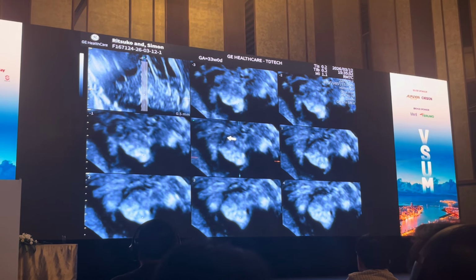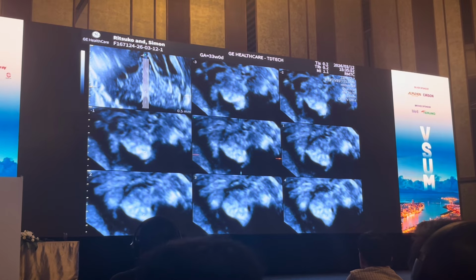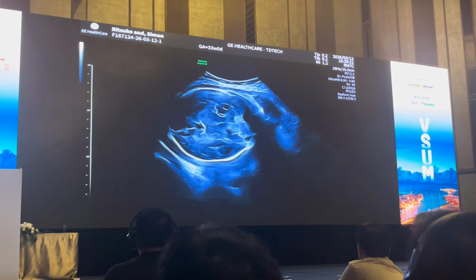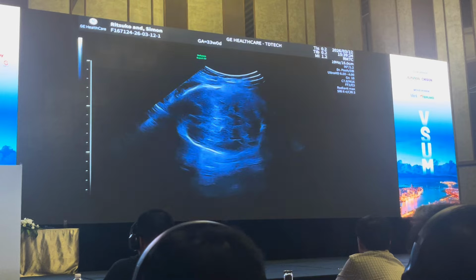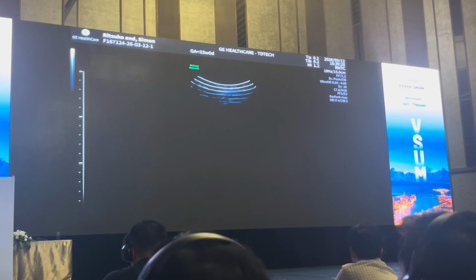And before I hand over the probe, because you're going to show me the temporal lobe, you're going to show us how to do it using multiplanar analysis. Or maybe you do that now too, but No, it's okay. So you want to keep going?